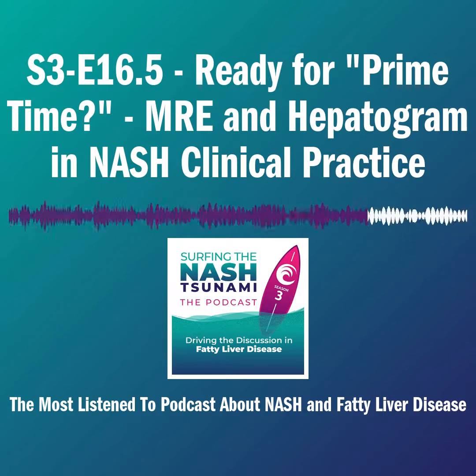So I called my hepatology colleague and said, well, I have good news and bad news. The bad news is that the MRE failed, but the good news is that I gave you a diagnosis that you didn't know. The ferritin was in retrospect. He had severe iron overload and he had unsuspected hemochromatosis. But sure, if it is technically successful and there's fibrosis related to whatever disease process, you'll pick up the stiffness quite well.